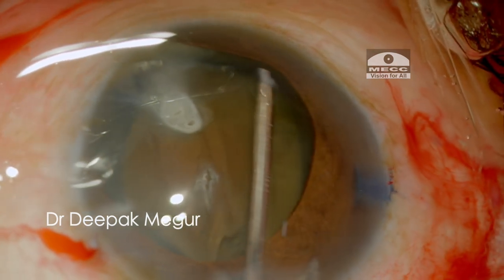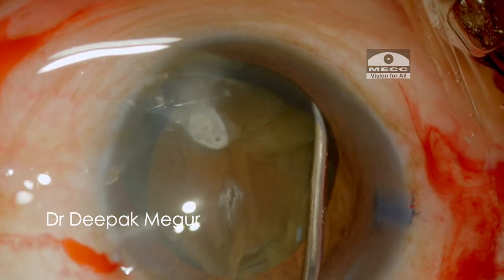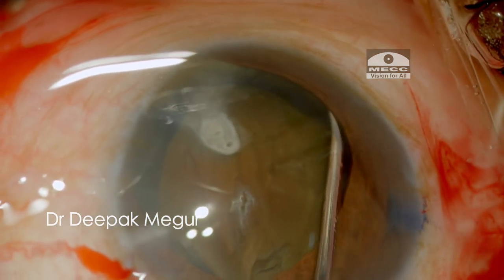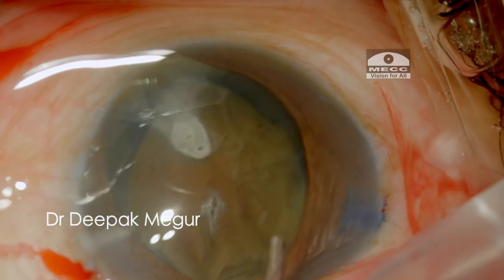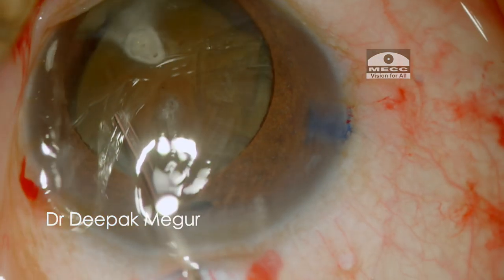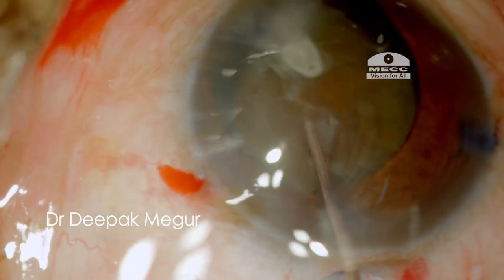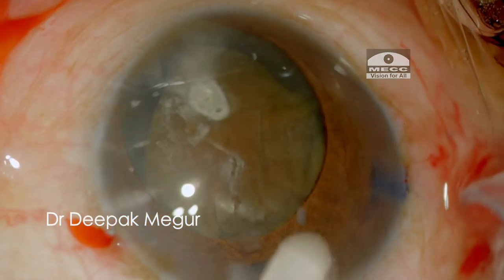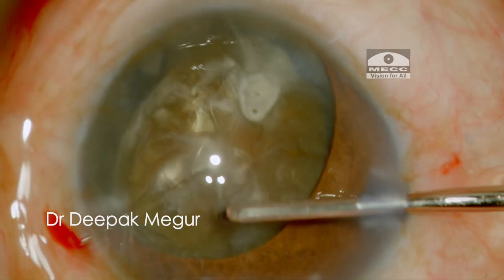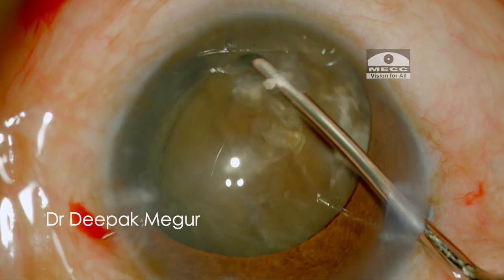Hydrodissection is gently performed by injecting a very small amount of BSS under the anterior capsule followed by decompression. Before proceeding with emulsification, I ensure that the nucleus is free from its attachments to the capsular bag by gentle rotation.